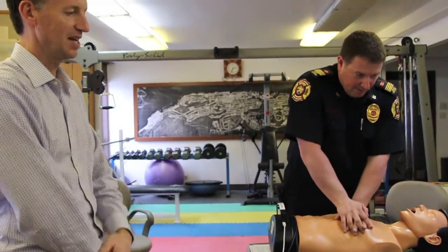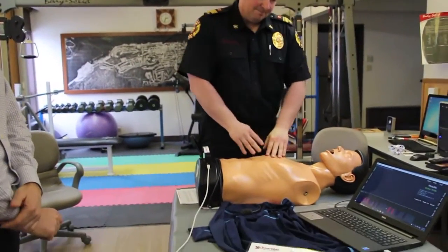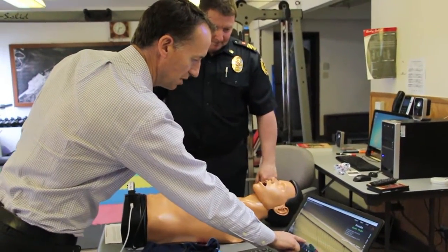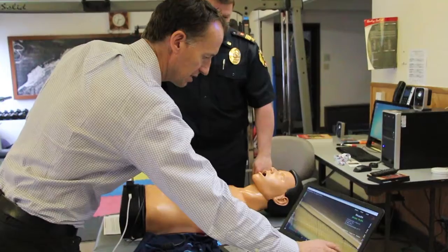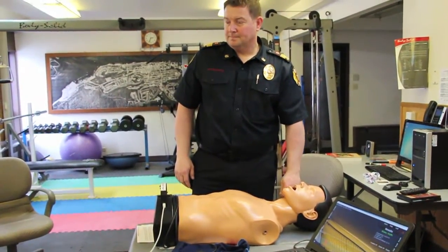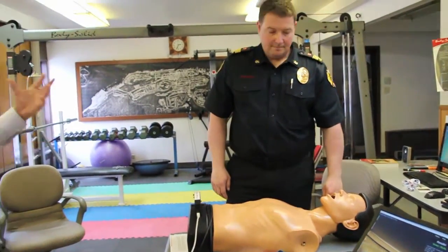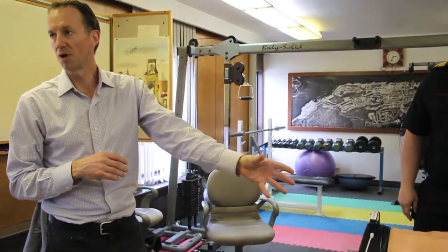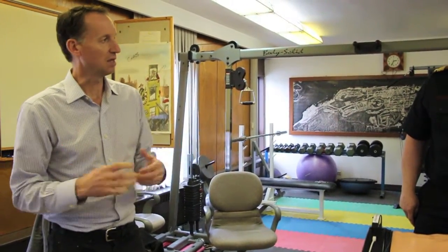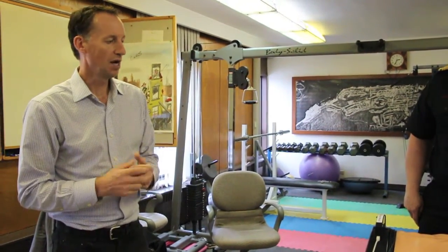Almost done — stop. Excellent. You started out needing to be a little bit deeper, and then your next cycle was perfect CPR: high quality, good depth, good rate, hands completely off the chest. That's the model of great CPR, proven by the device. That's why we think this is going to be an excellent tool to help with the training of the fire department.